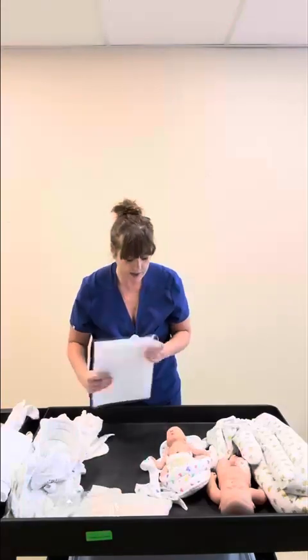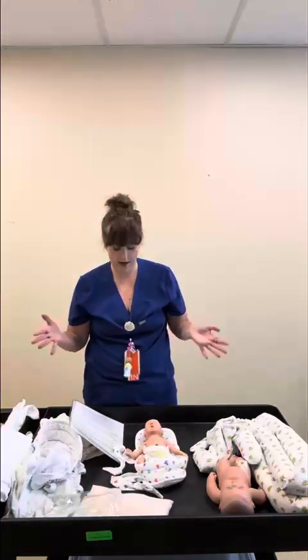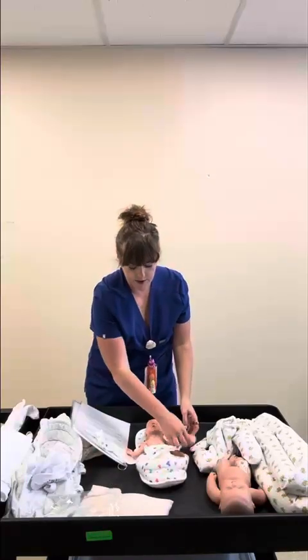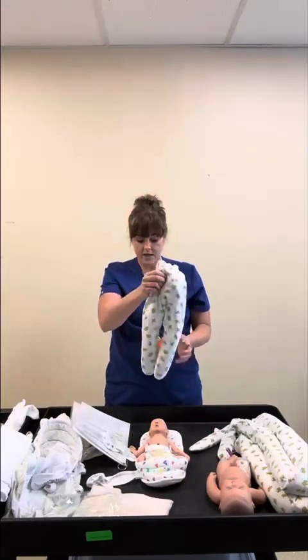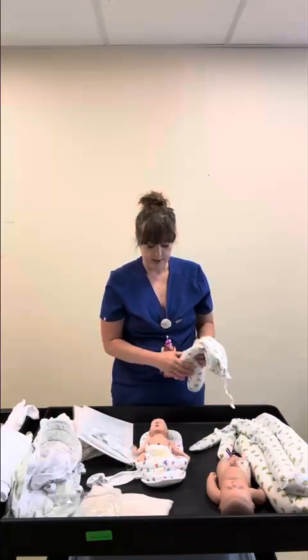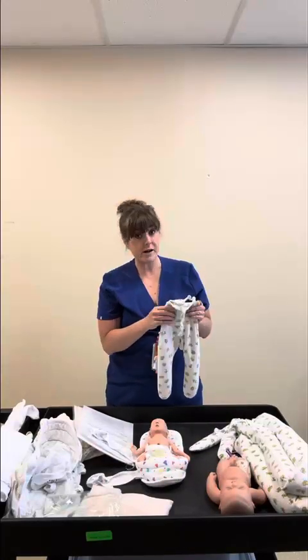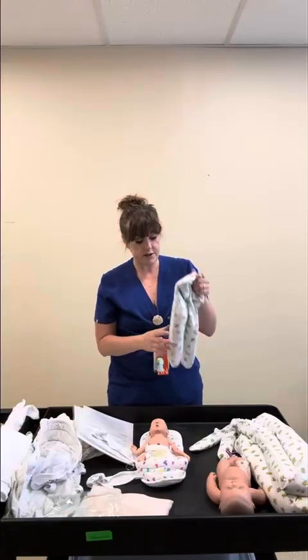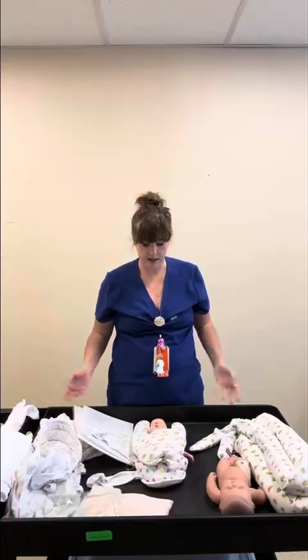The most important thing when your baby has lines is to make sure that you're able to visualize those on the regular, at least every hour. So don't cover up lines, and also they're going to be on skin control in the incubator at this weight and age, so don't cover up that temp probe with a bean bag or a strap. Do your best to keep that open. But their body surface area is really small, so sometimes that's a little more difficult. Again, make sure that you are not placing the bean bag on top of the baby.